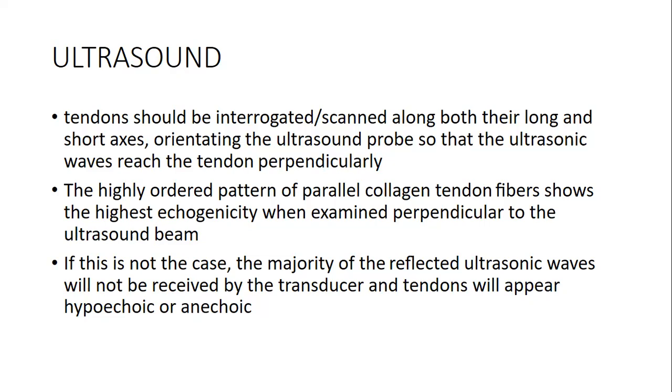The highly ordered pattern of collagen tendon fibers shows the highest echogenicity when examined perpendicular to the ultrasound beam. If this is not the case, the majority of the reflected ultrasonic waves will not be received by the transducer and the tendons will appear hypoechoic or anechoic. We'll see this when we get to the images.